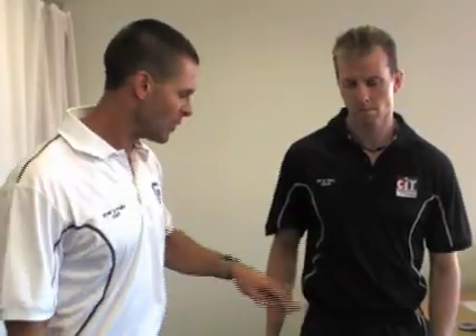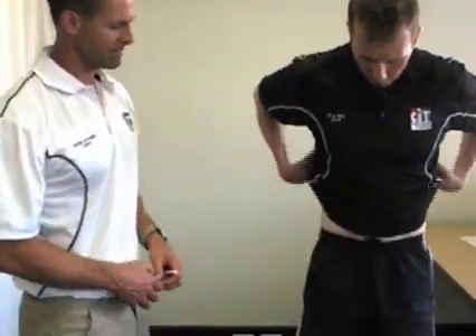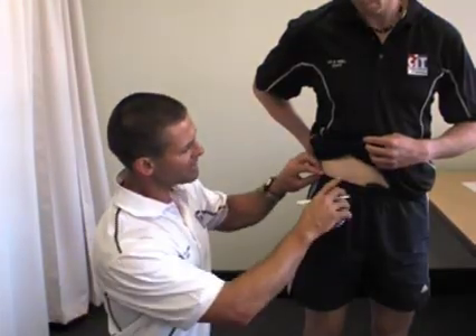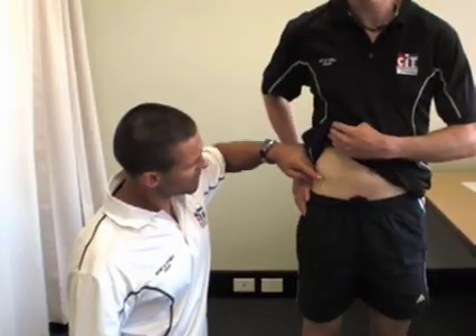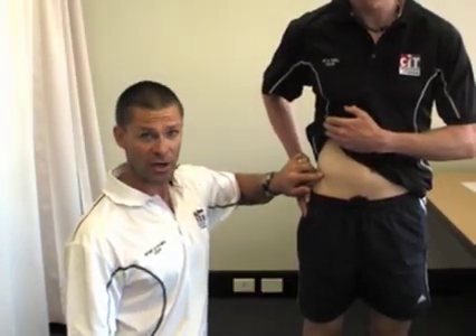Moving on, we're going to do Simon's suprailiac skinfold now. The suprailiac is located at the top of the hip bone, just around the waist. When taking this measurement, we inform the client and may need to ask them to bring their pants down slightly for good access to the suprailiac. We can see and easily palpate Simon's suprailiac here.